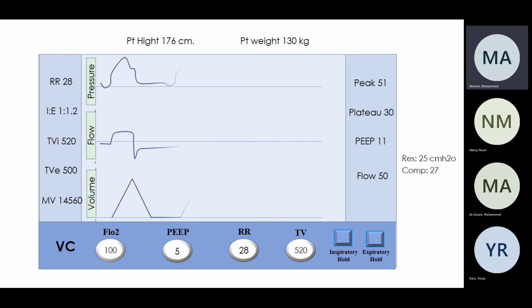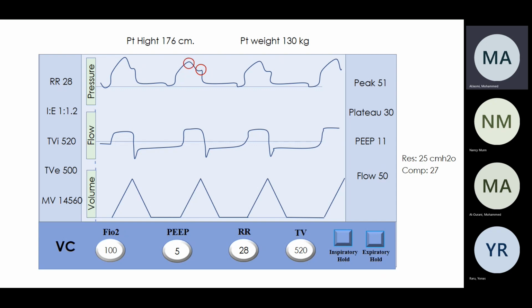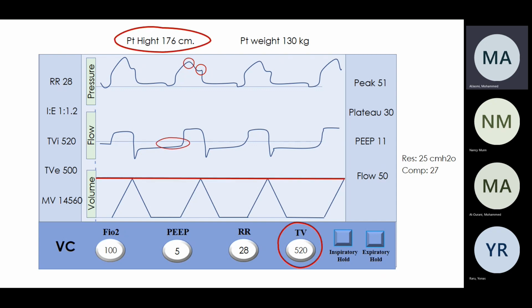Volume. You can't tell from the pressure-volume curve, the volume is higher. That's right. Sorry, it's not the delta volume, it's the tidal volume, the inspiratory tidal volume. Katie, you're asking about compliance. No, you see, that's a very good point. You see what the patient's volume is, because I'm giving 520 and the patient over there is 520 on the left. So he's getting the volume that I'm giving. Look at the volume in the machine. Maybe he's doing 600. Is that right? Okay, we're done.